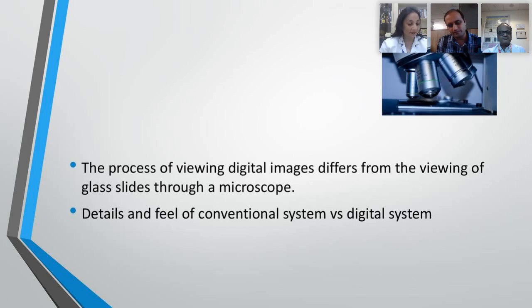and it is much better. And this change has to come, in what we are facing in this era of work from home. I'm not saying that I'll not go to the lab, but I would be very comfortable seeing slides at my home. If there are any urgent samples, it would take me time to go to the lab. Second, any odd hour samples, APML coming in at night, which we have all faced, I would be confident enough looking into a digital image at my home, though I would go to the lab to sign out the report at present, because of the Ross curve of change, as you know.